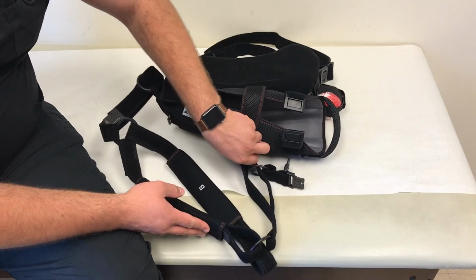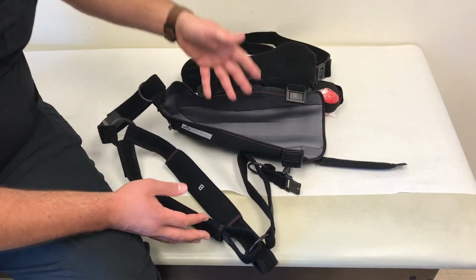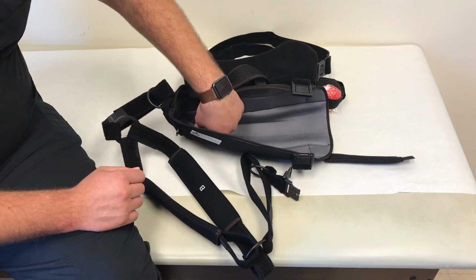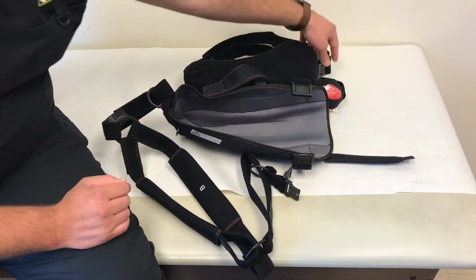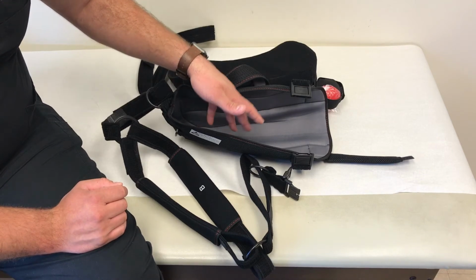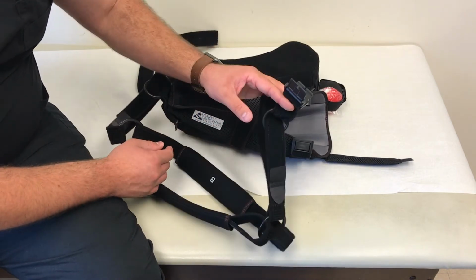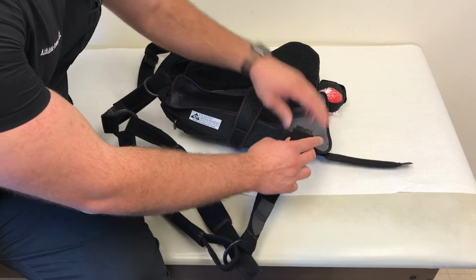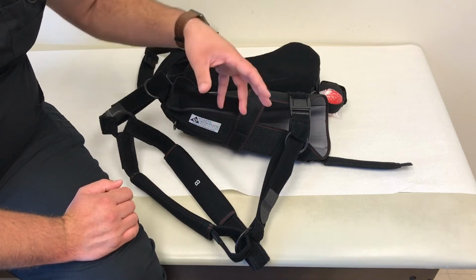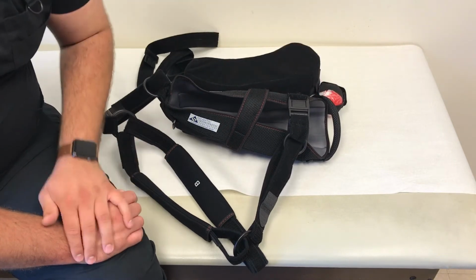So after you have removed those, you then unvelcro the arm holder as well as the thumb, and you can now go ahead and put your arm in the sling with your elbow towards the back of the sling here. And once your arm is in the sling, also unbuckle the swath strap as well. Once your arm is in the sling, you can then go ahead and start reapplying everything by closing the arm up first, reapplying the clips to the front, which now technically your shoulder is supported because those clips are fully attached now going around your body, and then reapply the thumb strap across the front of the sling as well.